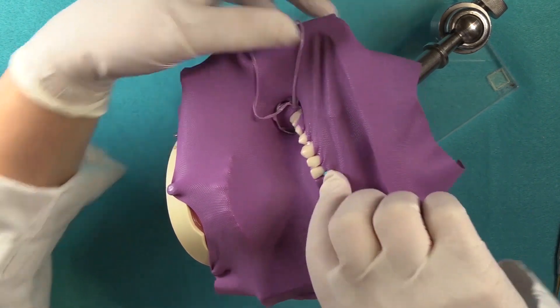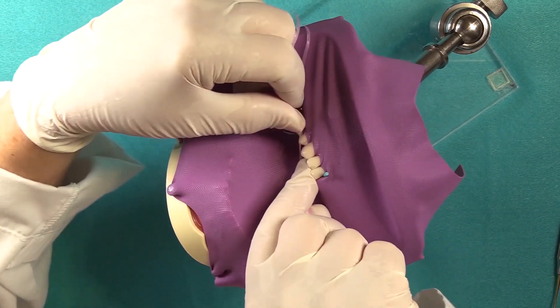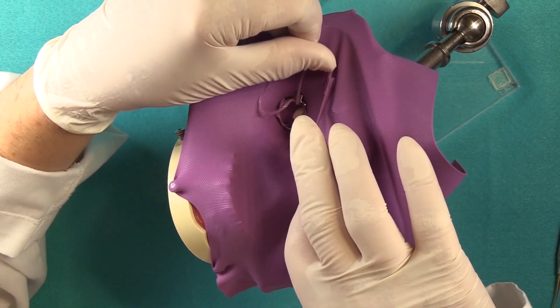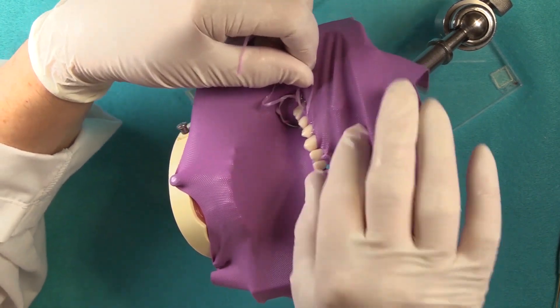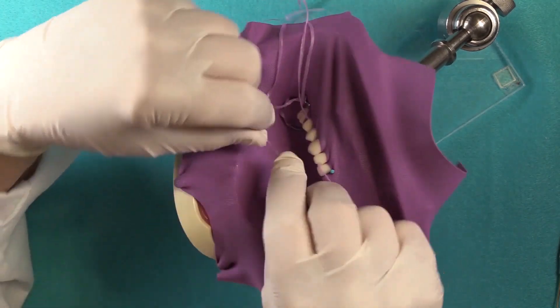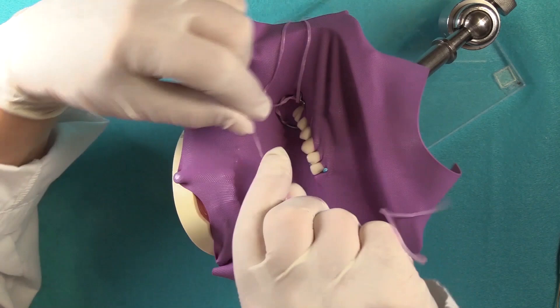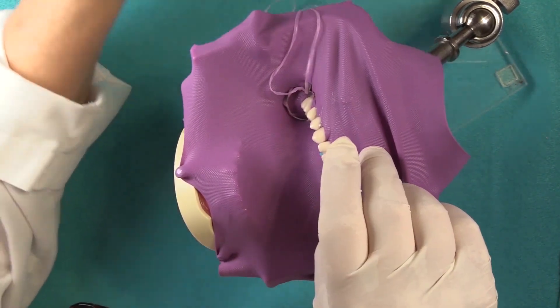We're working from the front to back — you can see I already have some of the material in place. I'm going to use some wax dental floss to carry the rest of the dental dam through the contact area. I'm using what I call the loop technique. What that does is it makes you more proficient in getting the material through, because I'm looping the floss through the contact and coming back through the same contact.